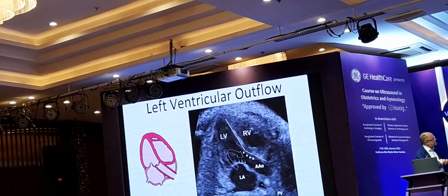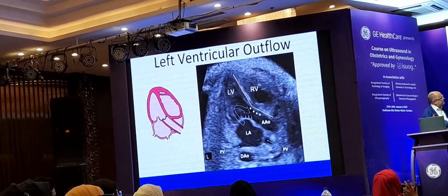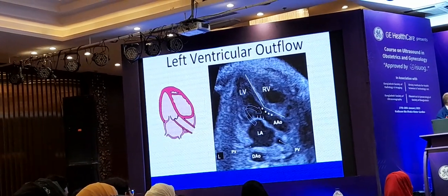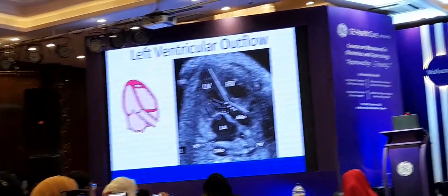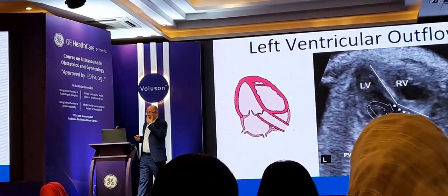That's the angle that I was talking about. Can you see those little stars all along? Yeah? So blood comes out of the left atrium into the left ventricle, out of the left ventricle, up the aorta. You've got no little gap between the left ventricle and the right ventricle. That ventricular septum is complete, and you have that beautiful curvature. It's not straight, it's a curve.